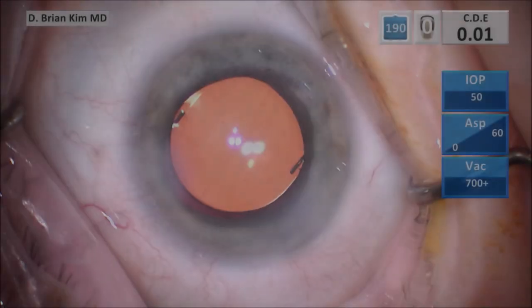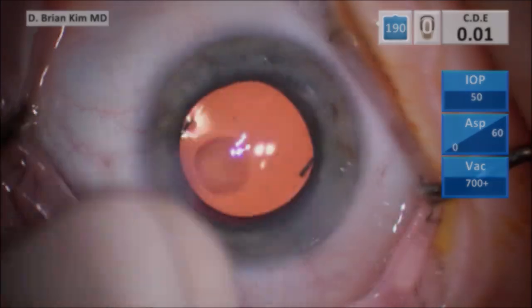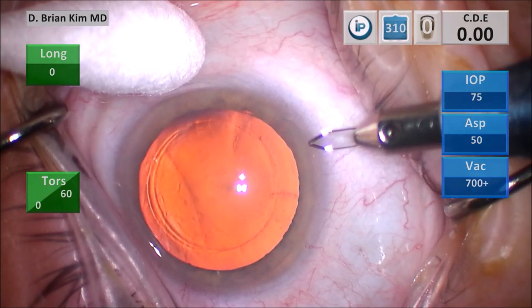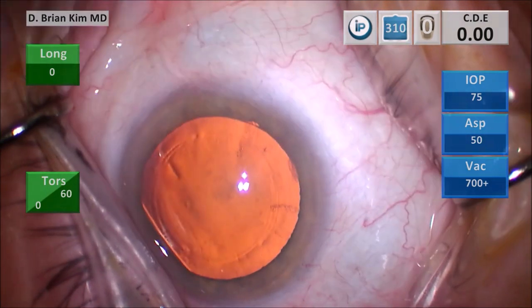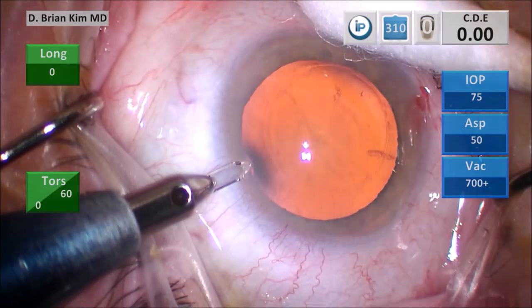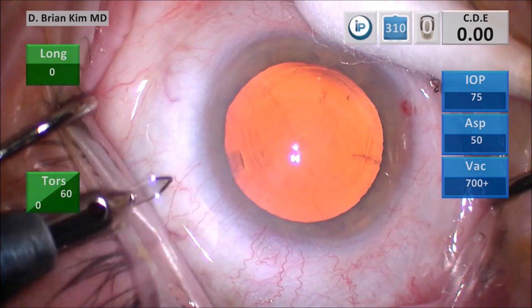Now that the case is completed, I'm using a cotton tip to check the dryness of the incisions. Going over multiple cases: after I make my corneal mark, I use a cotton tip to pull the eye to the left — it flattens out so I can approach the cornea in a more flat manner. Use a cotton tip to pull the eye to the right, and the left paracentesis is flatter. I'm able to make a rectangular paracentesis with a tunnel longer than the width of the blade.